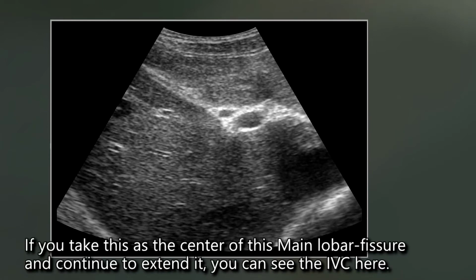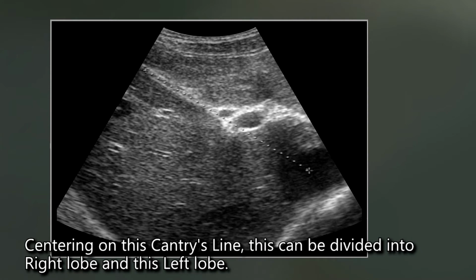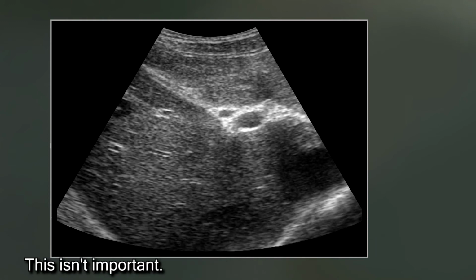If you take this as the center of the main lobar fissure and continue to extend it, you can see the IVC here. If you draw a straight line towards this IVC, this line is Cantlie's line. You can see it like this. Centering on this Cantlie's line, this can be divided into the right lobe and this left lobe. This isn't important.